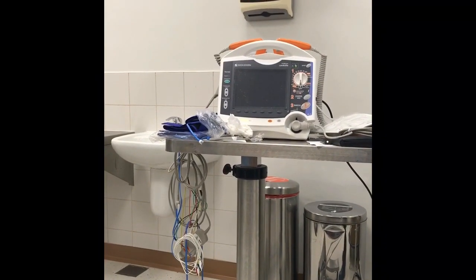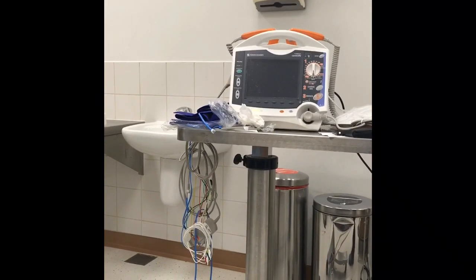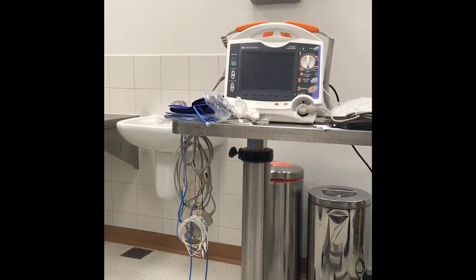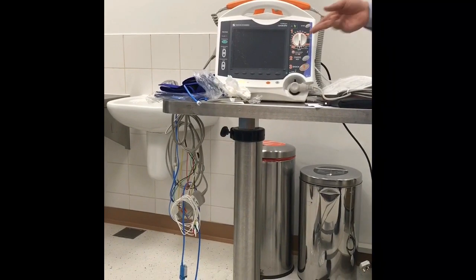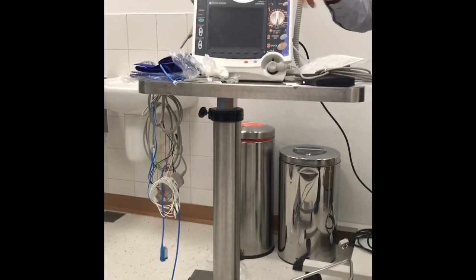So any questions up to now on the software? So monitor, AED, manual. Now we are going to pacing. Pacing, do you need me to explain pacing?